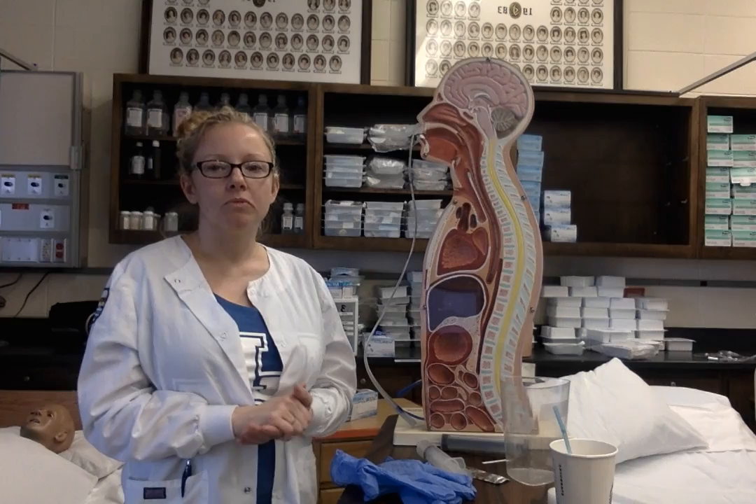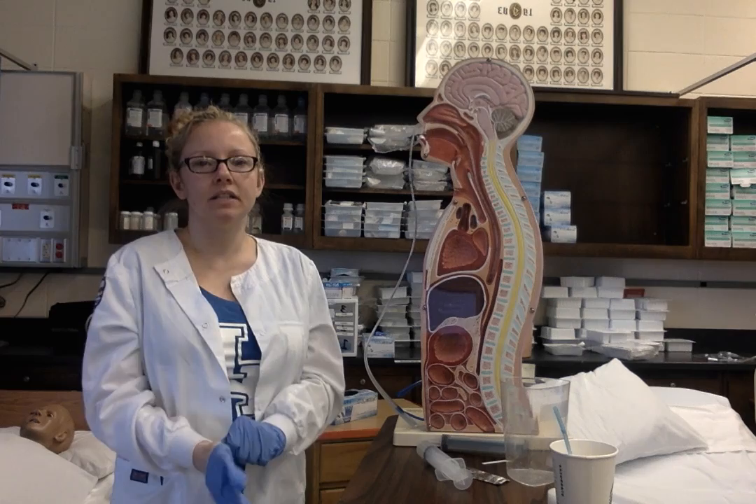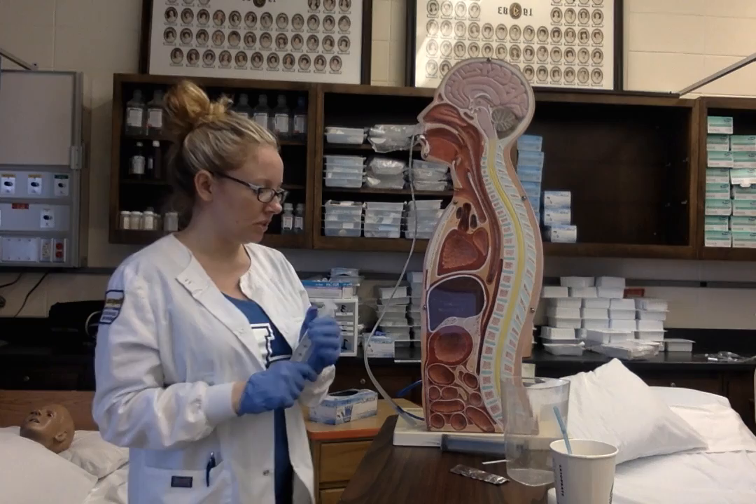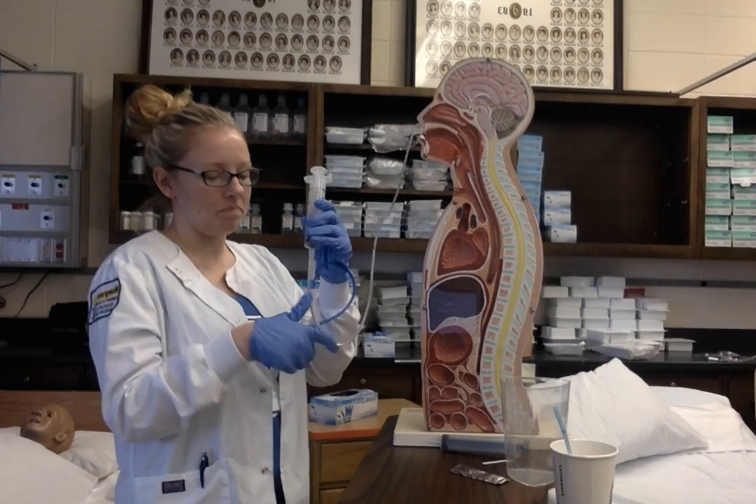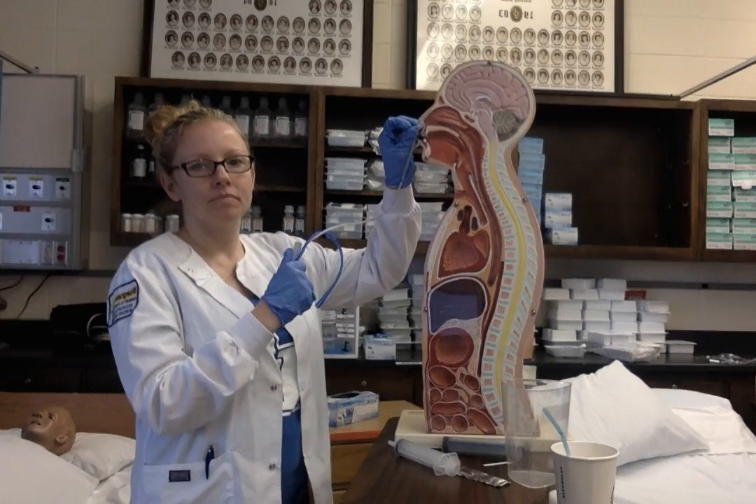I'm going to perform hand hygiene and put my gloves on. I'm going to turn off the suction and then disconnect the NG tube. I'm going to irrigate the NG tube with 20 mL of air. Then I'm going to remove the tape from the nose and unpin it from the gown.